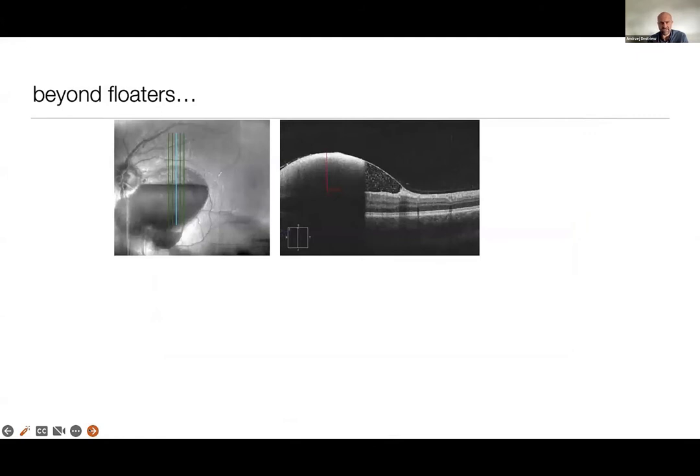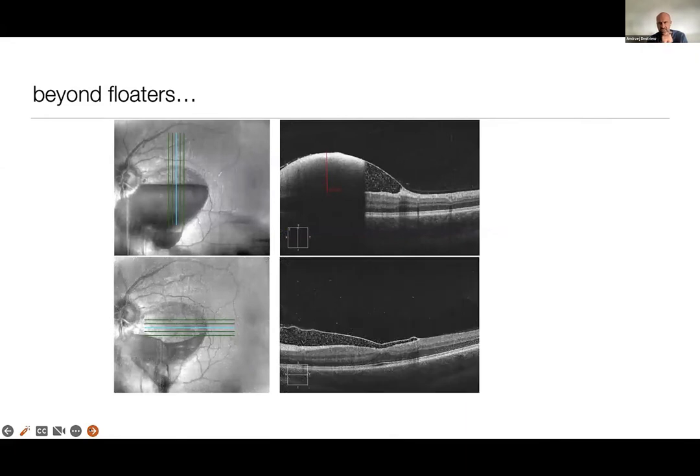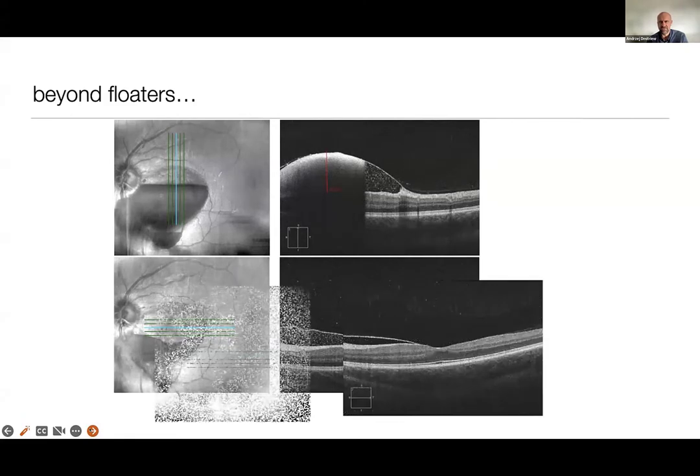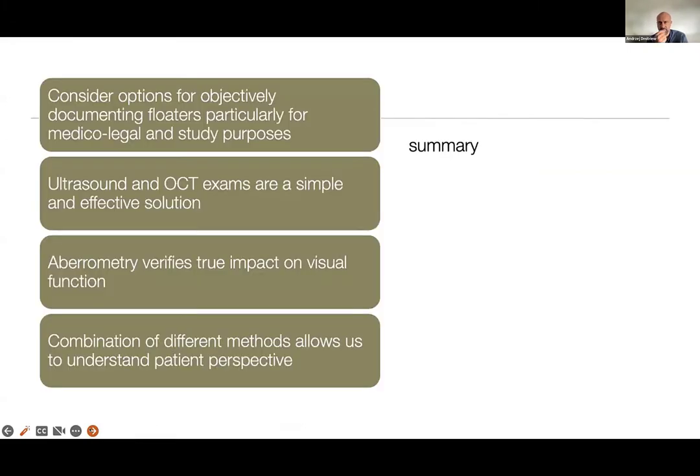Obviously, there's a lot more that OCT can do, and I always appreciate seeing the outcomes of sub-ILM hemorrhages and their treatment with YAG lasers, which is one of the most brilliant and spectacular applications of the YAG laser, and how we see the rapid improvement of visual acuity in those patients, and how easily we can assess what actually happens within that space with OCT.